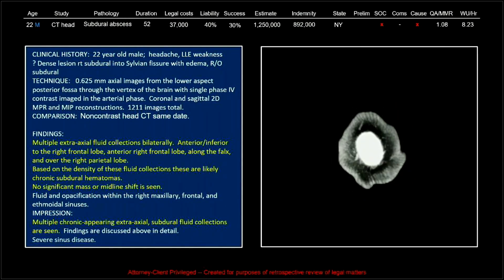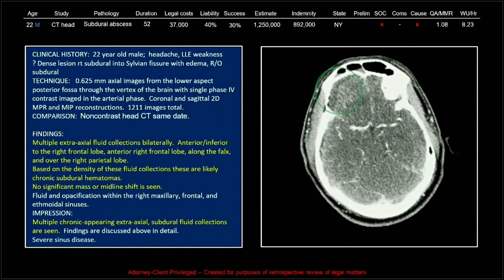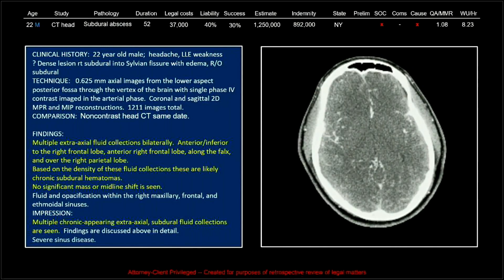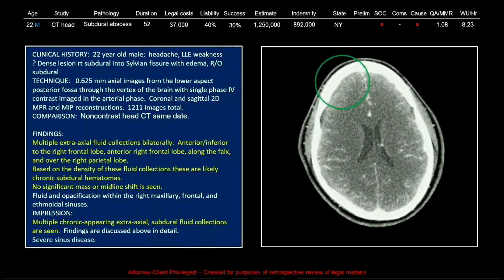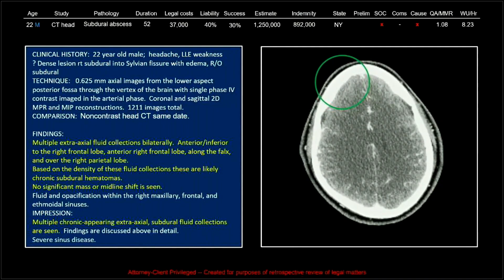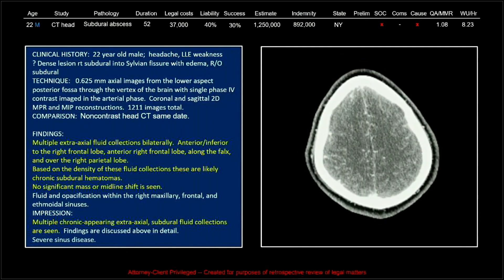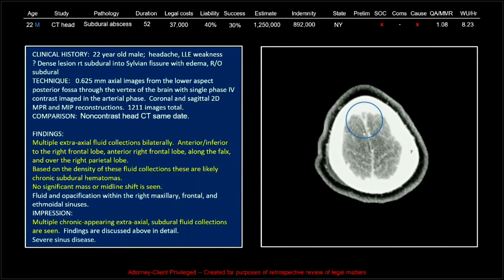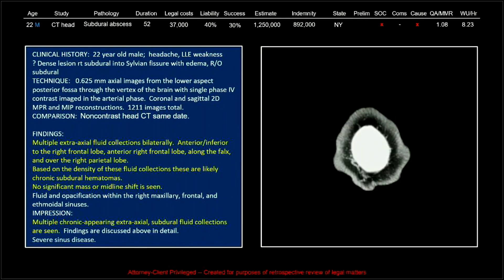So this was read as multiple chronic-appearing extra-axial subdural fluid collections, but this is an acute presentation with neurologic deficits. If you look up at the clinical history, it says: question dense lesion, right subdural, into sylvian fissure with edema, rule out subdural. That was a neurologist that was consulted, came in and looked at the initial CT and saw what our radiologist had not, and even put it in the clinical history when ordering the CTA.